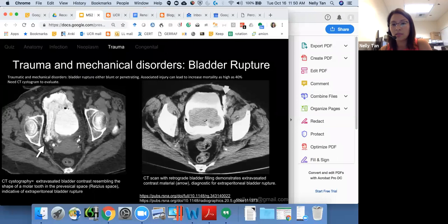Here we see this, what is this thing in the bladder? This non-enhancing dark thing. Any guesses? This filling defect that's floating in the bladder. Clot, yeah, this is a giant clot. The patient's probably bleeding, and so there's a large clot in the bladder. Good.